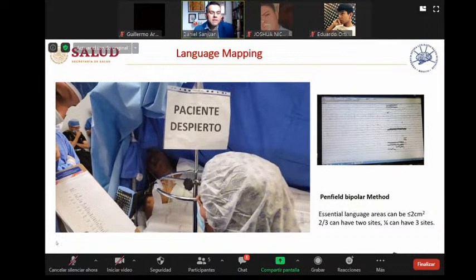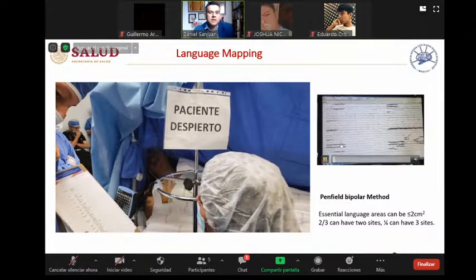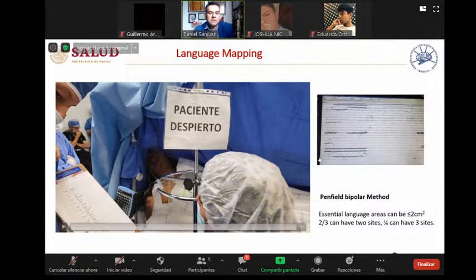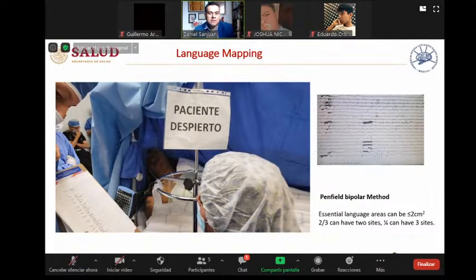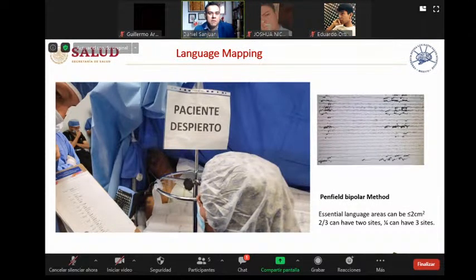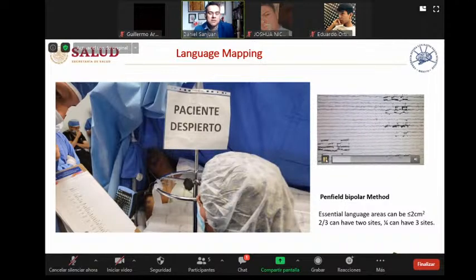So in this patient having a Wernicke or sensory aphasia, we use at the same time the electrocorticography just to see if the stimulus is active or not, and if we can see after-discharge during the stimulation, because if we see after-discharge the mapping is not good performance, because it's spread and it's a lot of energy that is spread, the stimulation is not focal.